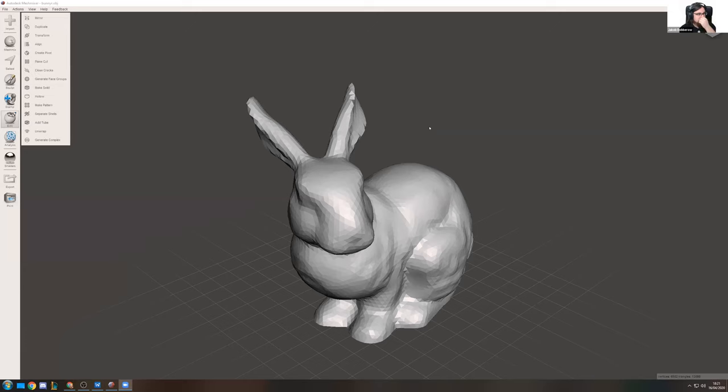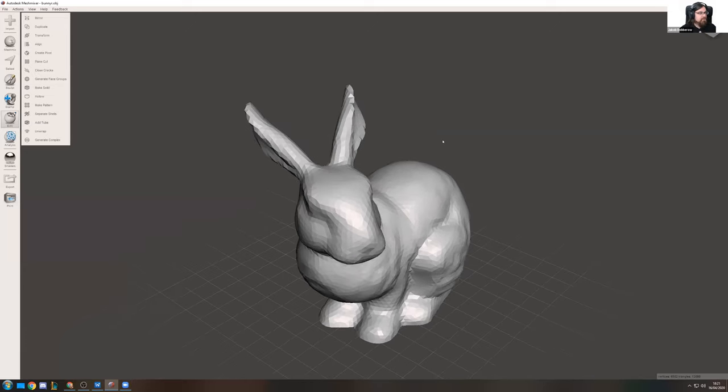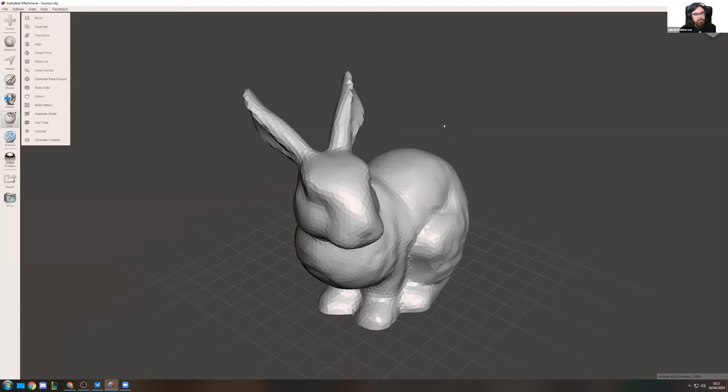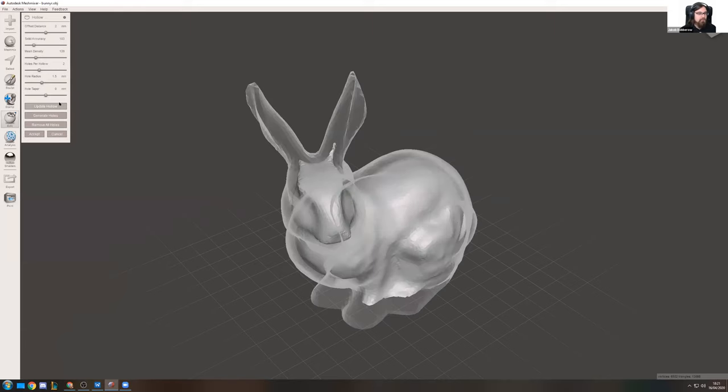This is the software which we have already talked about. It's called Mesh Mixer. You can just get this on meshmixer.com. It's for free. And you would just import your model. I've just been using this spun here, which is just a quick model. Then, just to show how easy it actually is, you would click on edit on the left side, and there's a function here called hollow. So you would click on there.